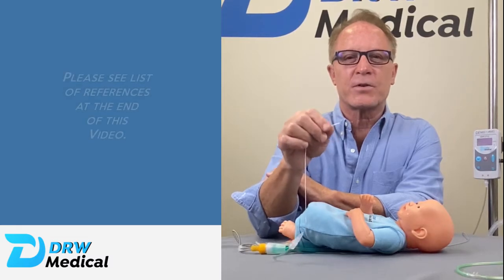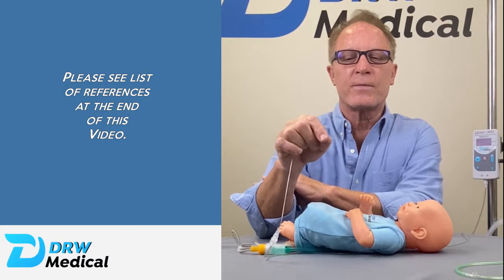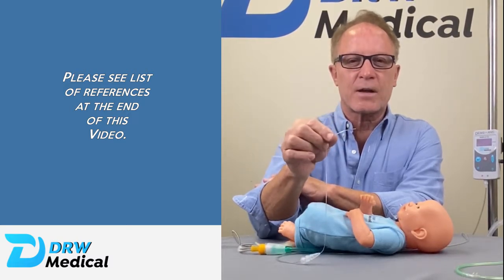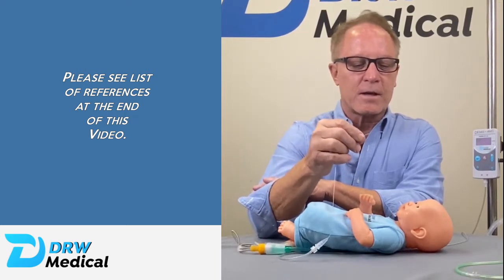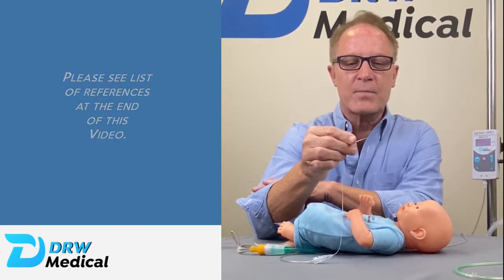Basically it's backing up what the literature already says and the tests that have already been done with measuring nasopharyngeal pressure — we're just making this commercially available. There's literature out there for the past ten years that have been showing the benefits of distending pressure equal to that of NCPAP.